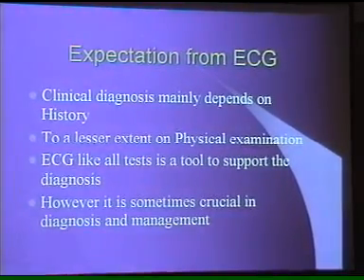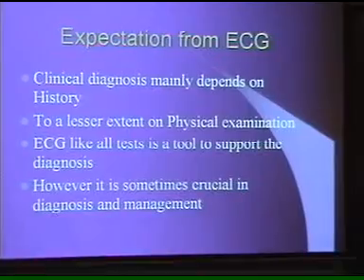Now, what do we expect from the ECG? The clinical diagnosis, we must realize, mainly depends on the history, and to a lesser extent, on physical examination. ECG, like all tests, is a tool to support the diagnosis, but is not the only way of making the diagnosis. We must be very clear about that. However, it is sometimes crucial in making a diagnosis and also in the management of the patients.